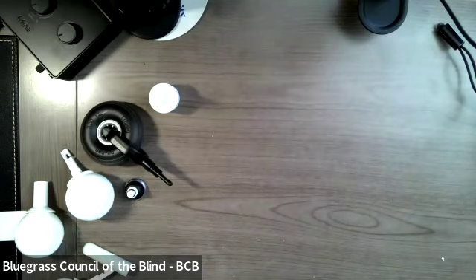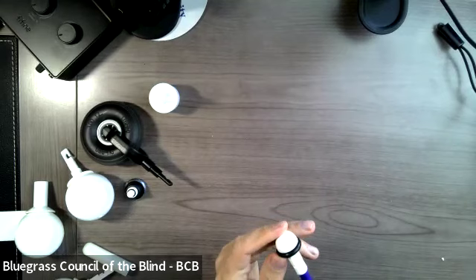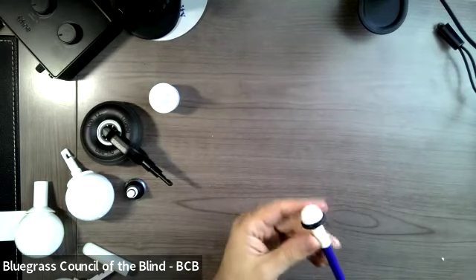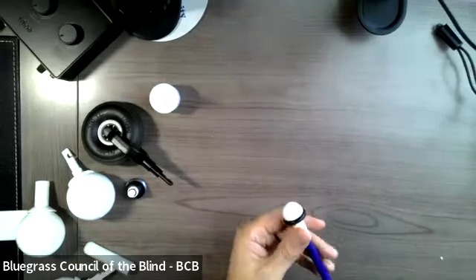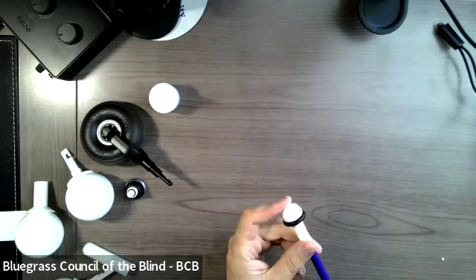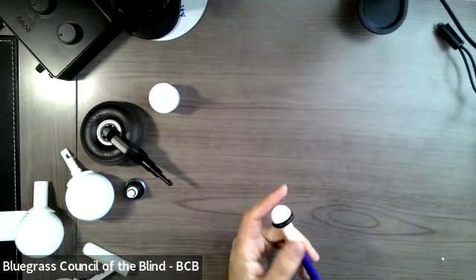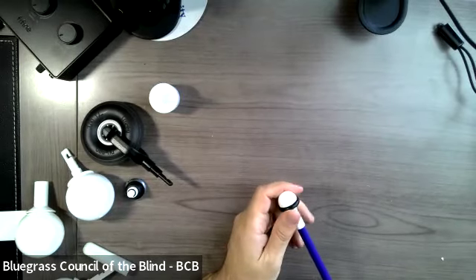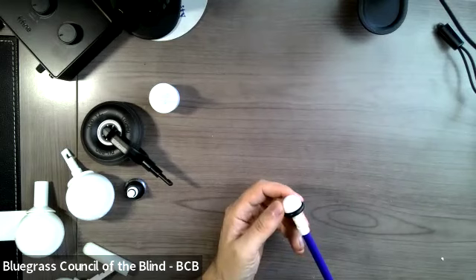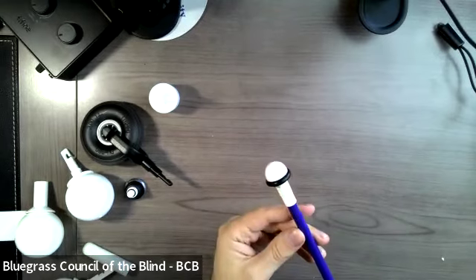And then another great tip, one of the super durable tips, is the ceramic tip. It looks like a little, I guess, a ceramic marble at the end of your cane, and it's about an inch wide. But it is extremely durable. I mean, it's made out of ceramic, so it's going to last for a long, long time. If you are constant contact, this is going to be pretty good, although it will tend to get caught in the cracks and things because it's not very large. But like I said, super durable. A lot of people really love the ceramic tip.